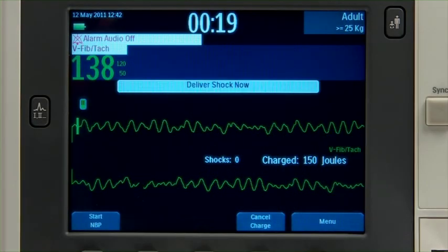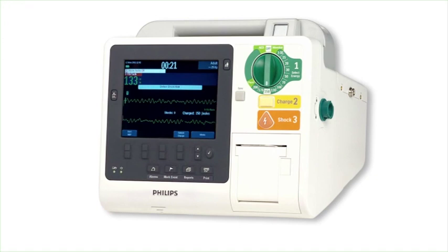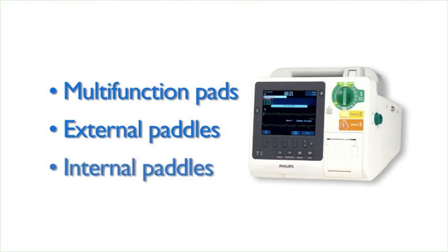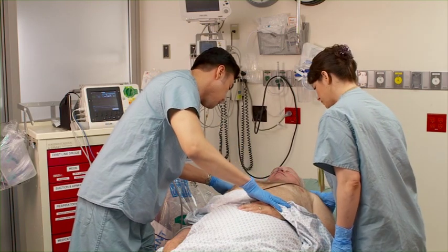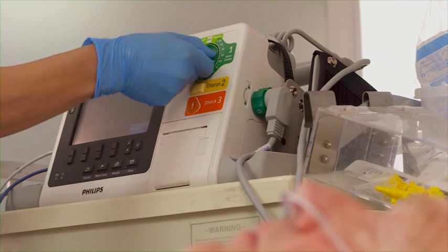With manual defibrillation, you control the defibrillation process. The HeartStart XL Plus lets you perform manual defibrillation using multifunction electrode pads, external paddles, and internal paddles. Here we'll demonstrate manual defibrillation using external paddles. After assessing your patient, determining that defibrillation is necessary, and preparing the patient, set the therapy knob to the desired energy for the patient.